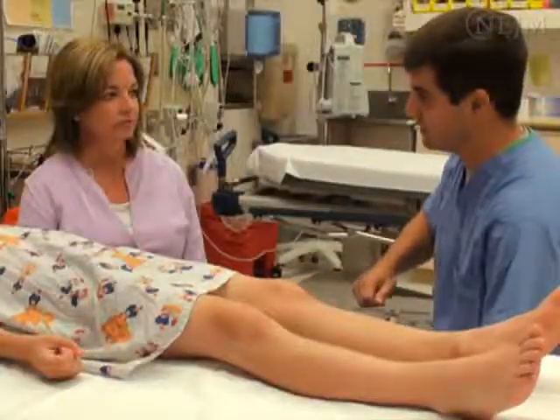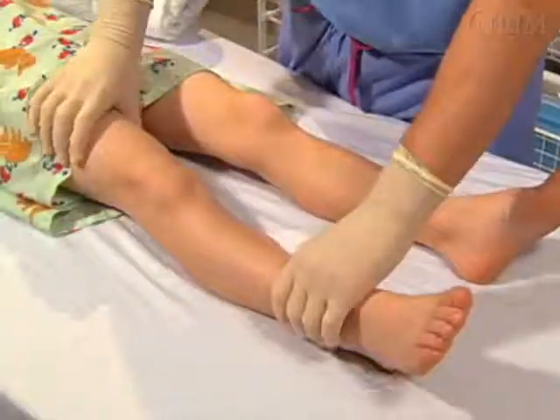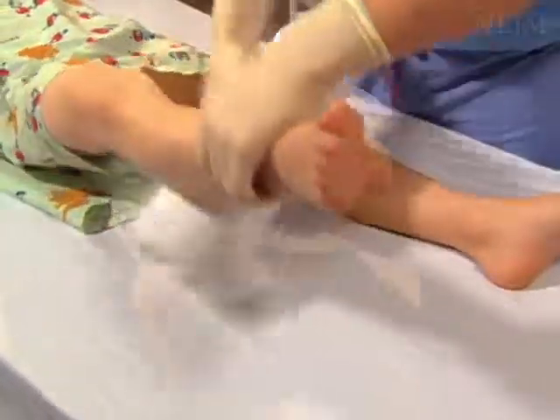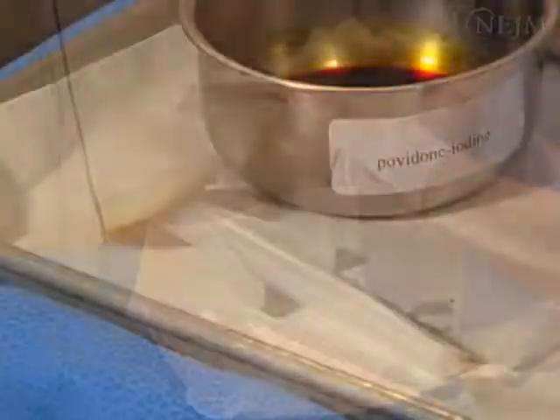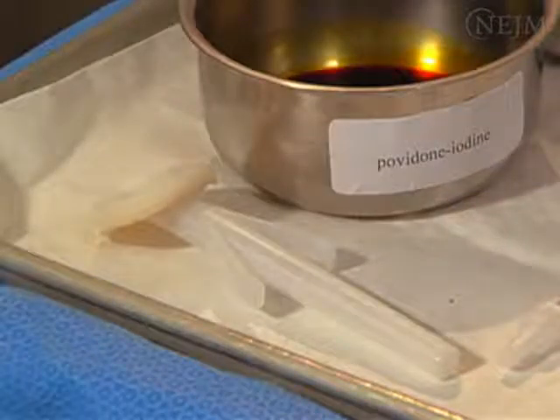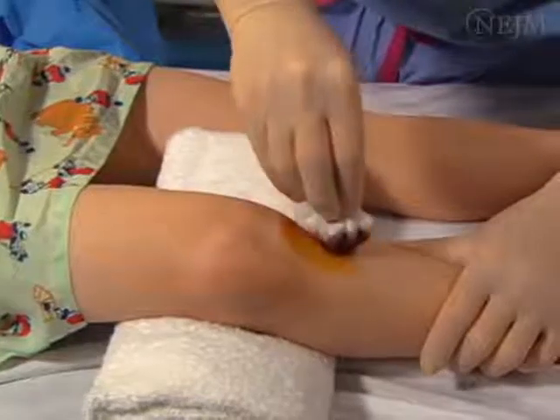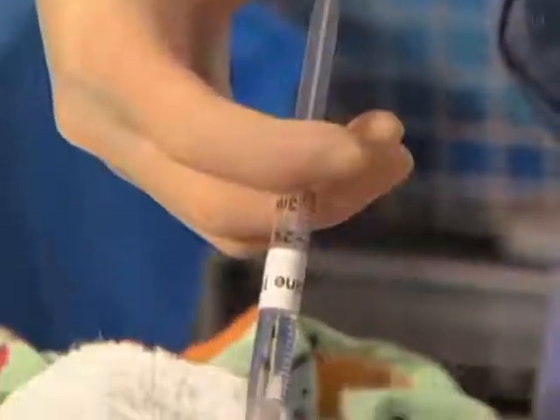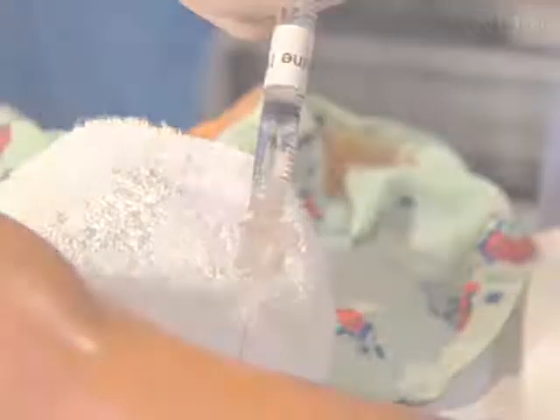Explain the procedure to the conscious patient and to any family members who are present. Position the patient so that the selected insertion site is easily accessible. Wear protective eyewear and sterile gloves. Using aseptic technique, clean the chosen insertion site with either chlorhexidine or povidone iodine solution. In awake and alert patients, infiltrate the area with lidocaine to provide local anesthesia.